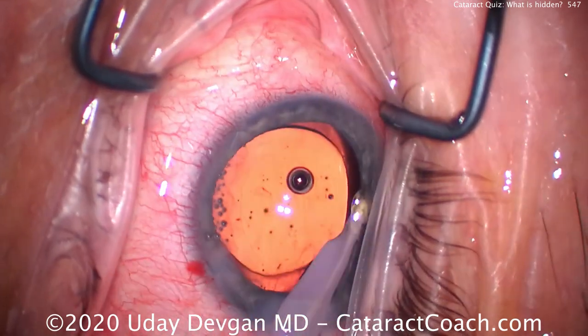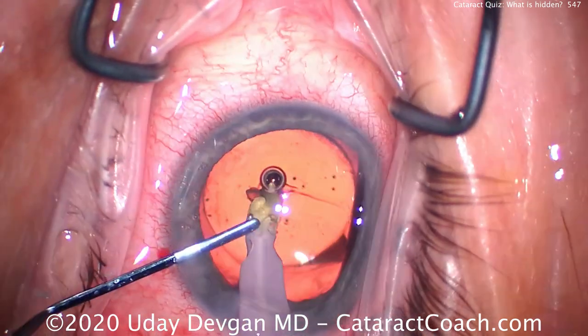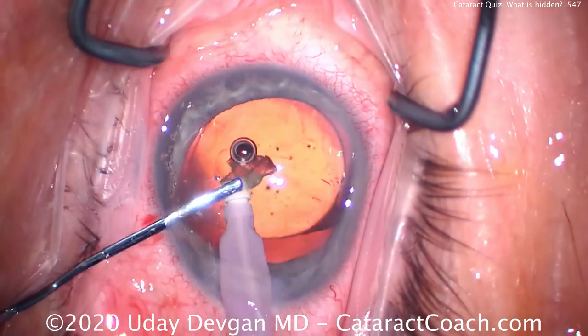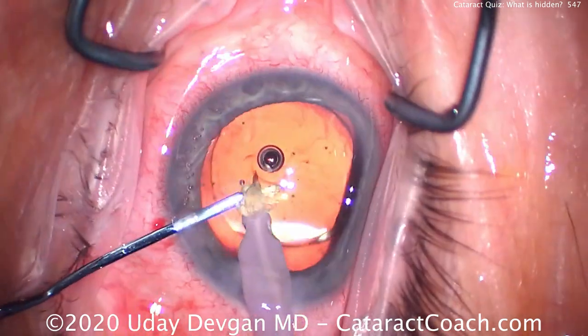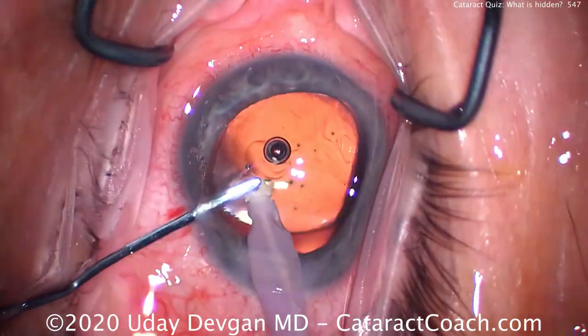It's important that we don't leave behind these retained lens fragments — they can cause a lot of inflammation in the post-op period. It's much easier to just aspirate it down, use the spatula to mush it into the port, and get rid of the whole thing. Then be careful: when you saw that one piece, let's just make sure there's nothing else hiding as well.